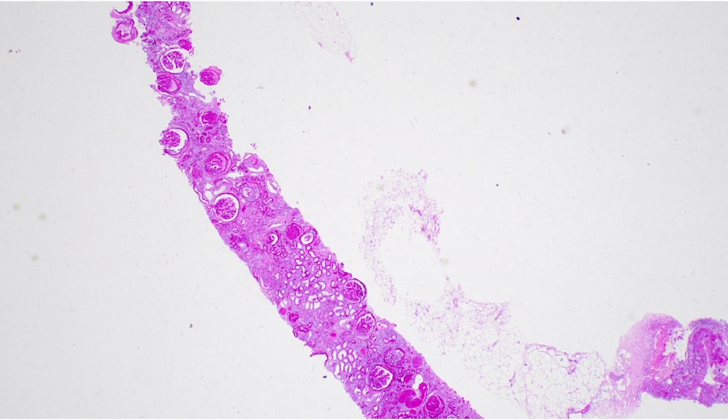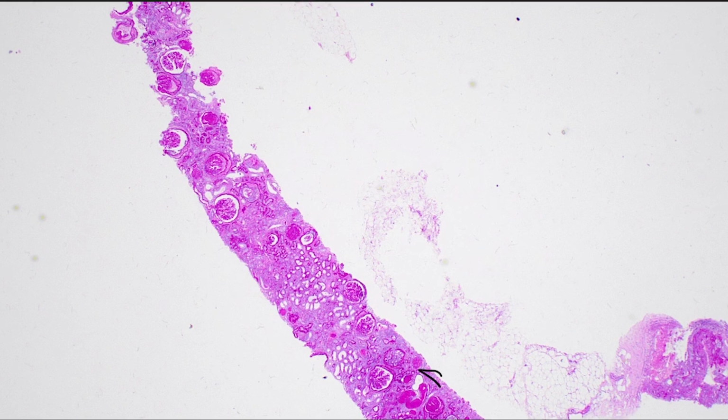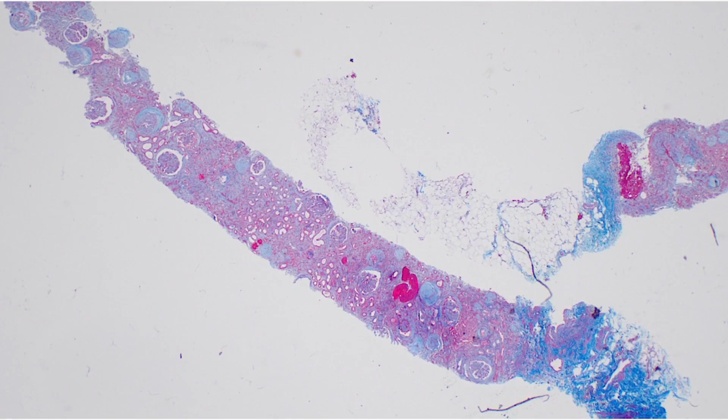So what did light microscopy show? Okay, so here we have an overview of our biopsy. We can see that there's quite a lot of chronicity. About 16 out of 27 glomeruli were globally sclerotic, and the interstitial fibrosis and tubular atrophy is severe. You can see some of the tubules over here are dilated with Tamm-Horsfall protein. And when we go to our trichrome stain, again, we can see severe interstitial fibrosis and tubular atrophy.